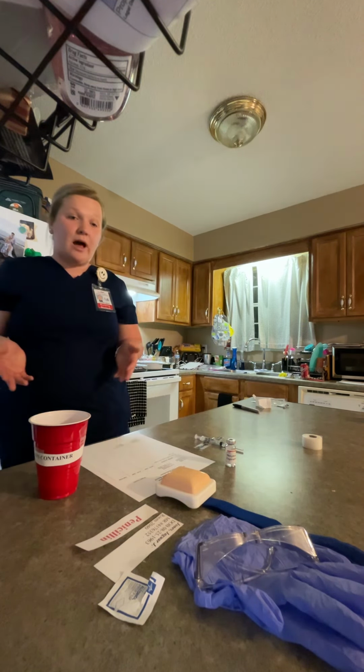Now I'm going to check the right medication, morphine sulfate, 5 milligrams. This is a 10 milligram per milliliter bottle, so I would give 0.5 milliliters, 5 milligrams or 0.5 milliliters. This is an intramuscular injection.